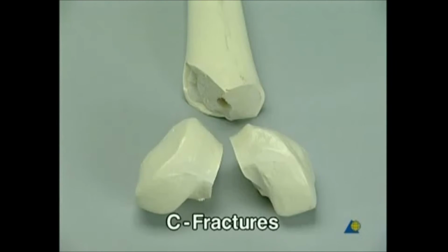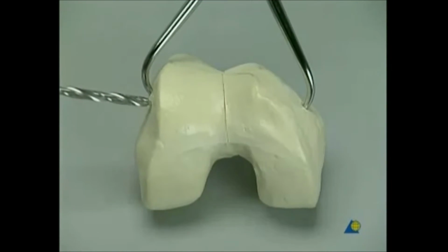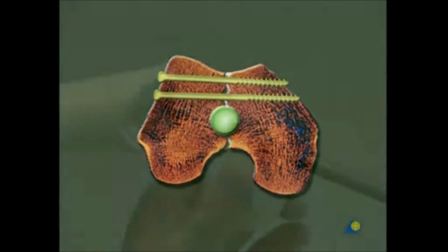The procedure for C fractures. In cases of intra-articular fractures, the condylar mass requires treatment first. After reduction of the fracture, the position is held with reduction forceps, and before insertion of the nail, is definitely fixed with 2 cancellous lag screws. These screws should be positioned as far ventrally as possible, so as not to interfere with the nail, which is, as a rule, placed dorsally.